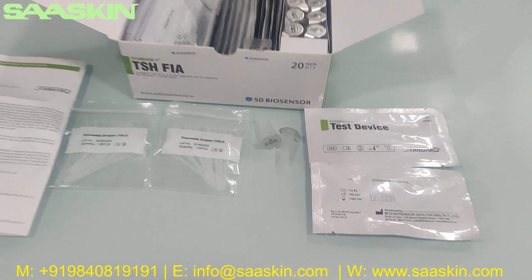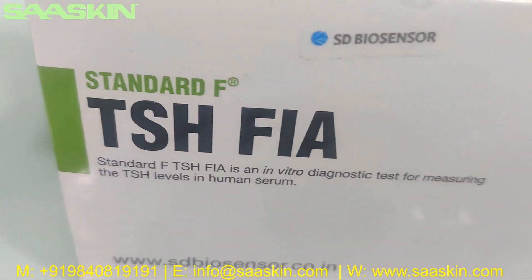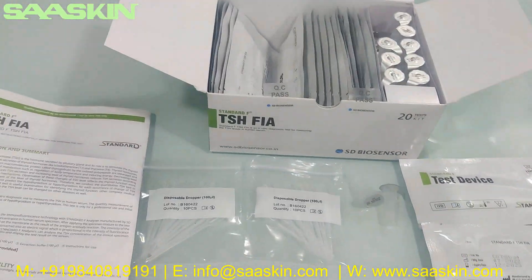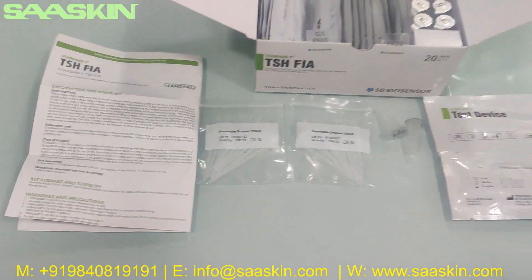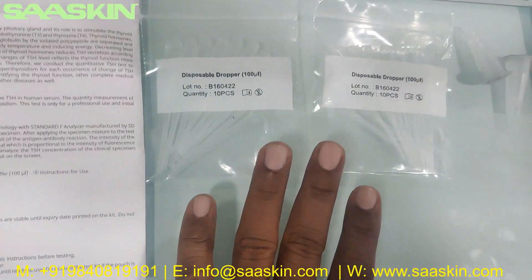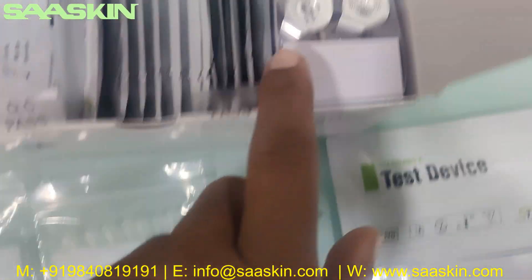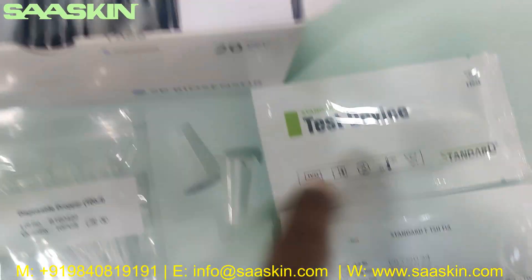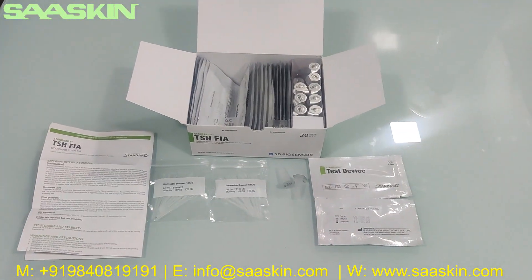Just to quickly summarize: today we have seen the unboxing of SD Biosensor STANDARD-F TSH FIAT Test Kit, used for thyroid hormone analysis. In this 20 test kit box you get one IFU brochure, 20 disposable droppers, 20 extraction buffers, and 20 test cartridges. This is how the total test kit looks like. Thank you.